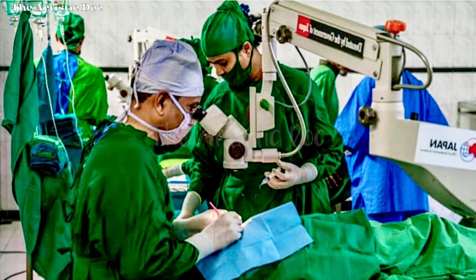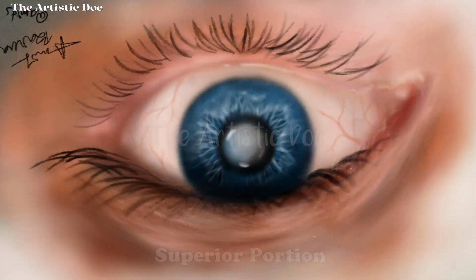Operation is done from the head end of the patient. So here the superior portion of the eye is placed towards your side, or in the inferior side of the screen.